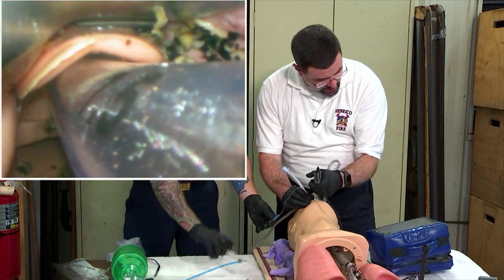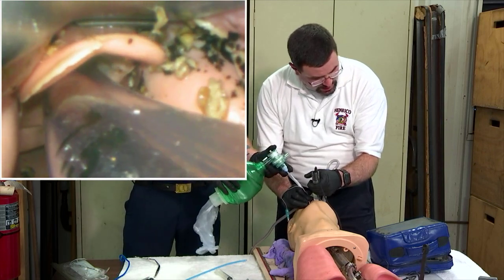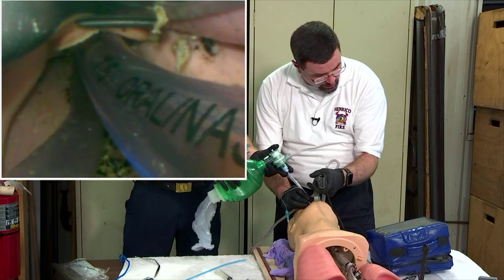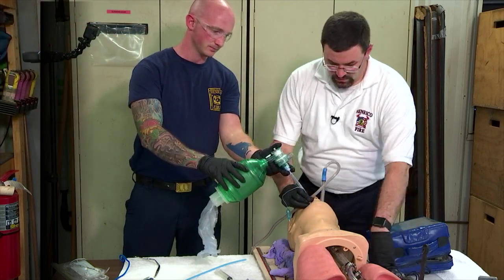And you'll notice in the back there that vomit is continuing to come up, but instead of contaminating my view of the airway, we're actually continuing to decontaminate it. And as I come out, you'll be able to see where the catheter remained throughout the intubation attempt. All right.